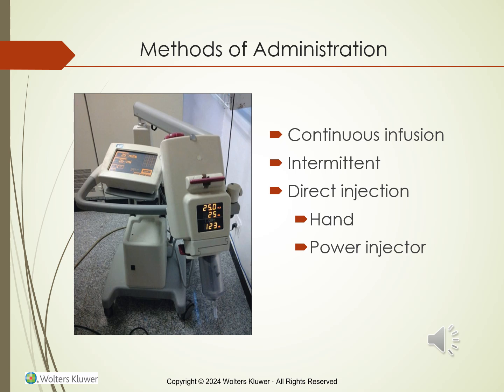A power injection is another tool commonly used in radiology. It ensures clear imaging of anatomy, including the arteries as well as the veins. This is especially used in CT and MRI imaging. Since the injection is under pressure, not hand injected, it's important to follow proper procedures to avoid complications like extravasation or air embolism. Special care is needed for pediatric cases with slower injection rates and a lower pressure and smaller doses of contrast because their veins are smaller.